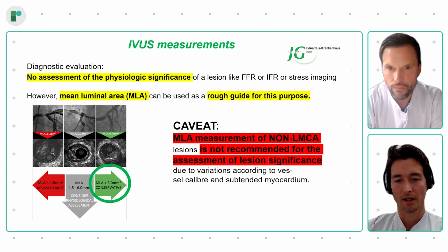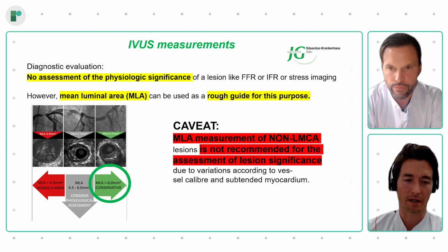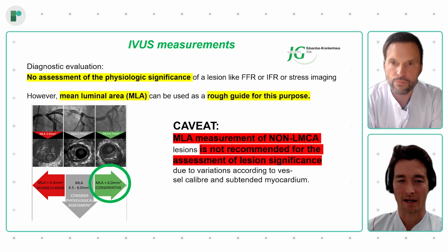Yeah, I strongly agree. And sometimes people say that it is of academic value whether the plaque is fibrous or lipidic. But it's not only academic.